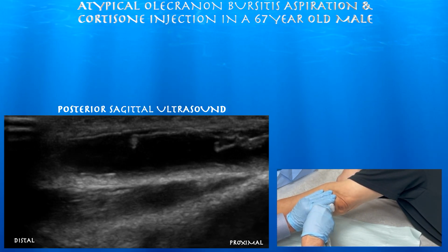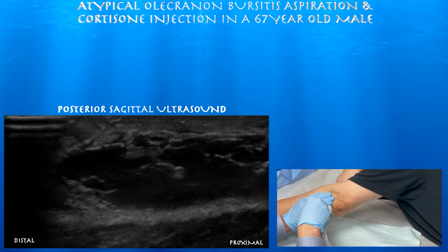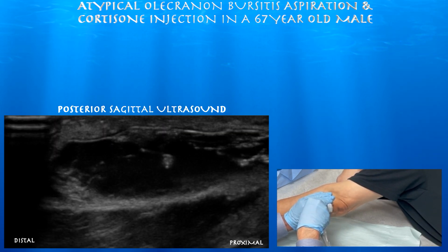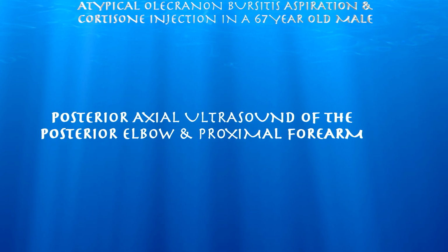See multiple septations here in this chronic bursitis as it is attempting to organize itself, but he still has a fair amount of compressible fluid within this large cyst.